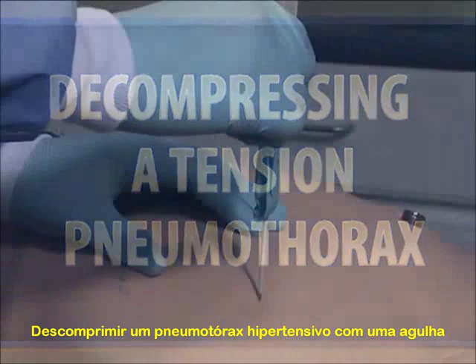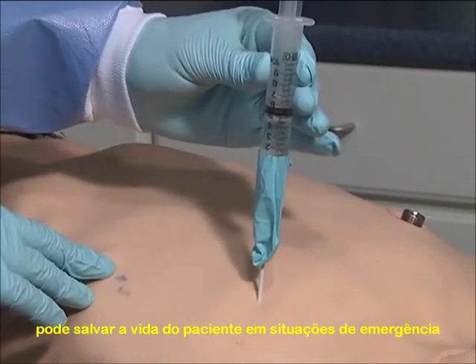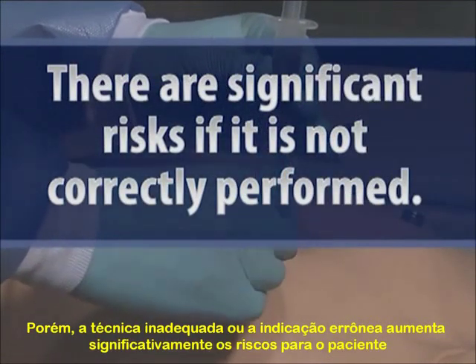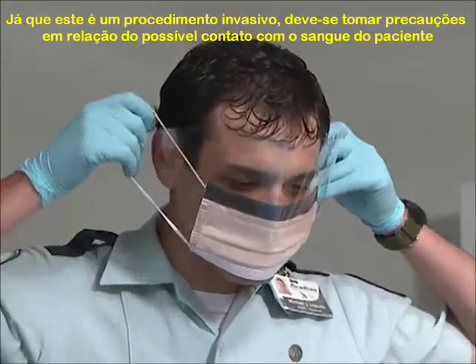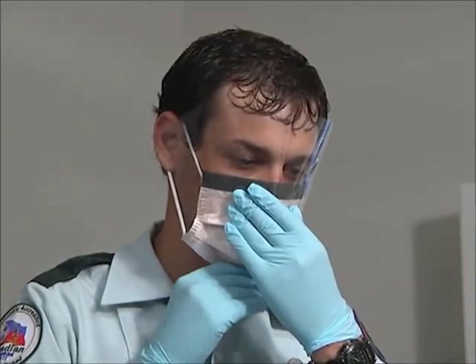Pressing a tension pneumothorax with a needle chest decompression can be a life-saving procedure. However, there are significant risks if it's not correctly performed. The first step is to take proper infectious disease precautions. Since this is an invasive procedure, a possibility exists for exposure to the patient's blood.